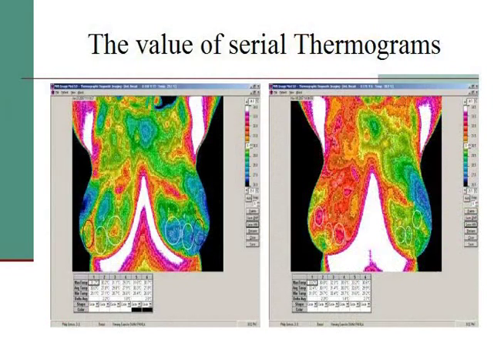Okay. Here's a woman who, in the left-hand picture, had what I thought was a breast cancer physiologically. And I said to her, you need to get something done. And she said, I'm fine. Nothing's going to happen to me. And 6 months later, the right breast was so hot it was basically on fire.